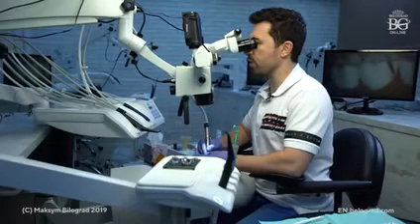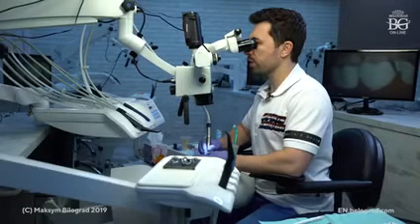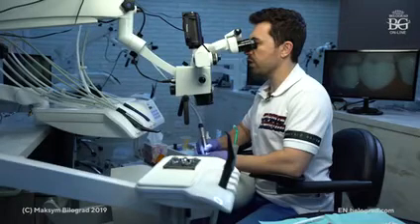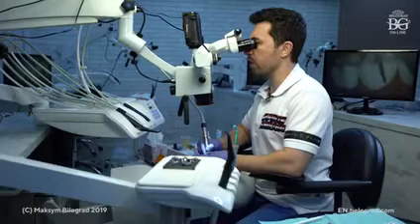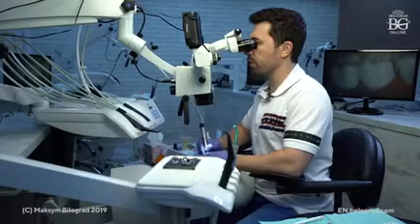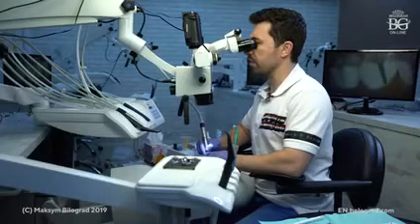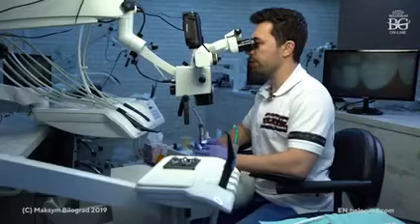This is important, by the way, to move more here, because you need to mask that transition, especially if your patient has a pretty wide smile frame. And just imagine this can be visible and your patient will be unhappy with veneers that are not masking the black or dark color of teeth.